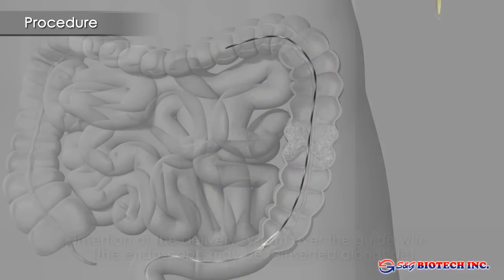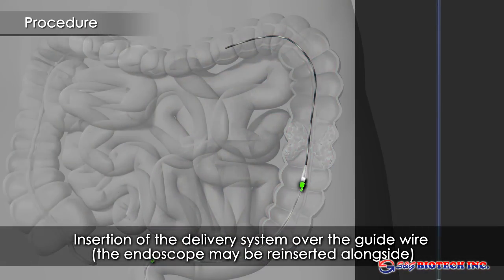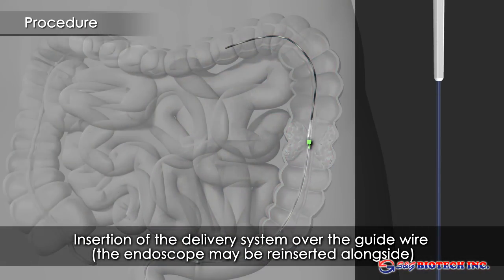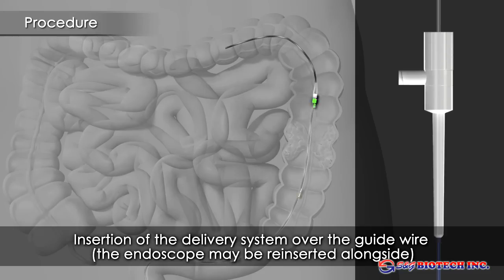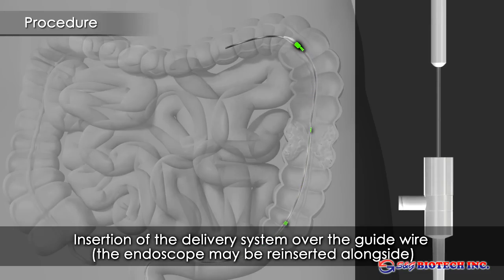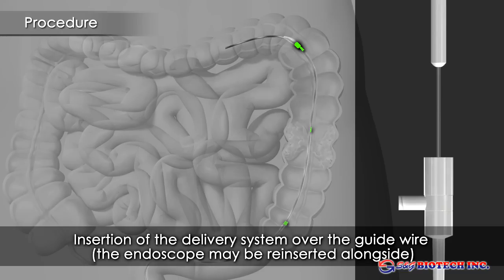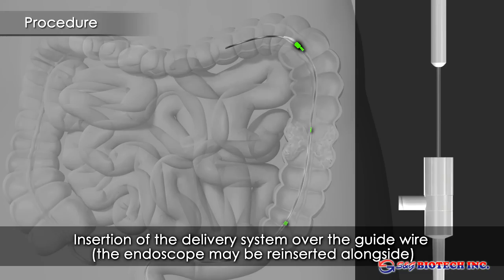After placement of a 0.035-inch stiff or nitinol wire, the delivery system is advanced through the stricture. Ideally, this is done through a large working channel, but the endoscope may be removed and placement performed over the wire only.